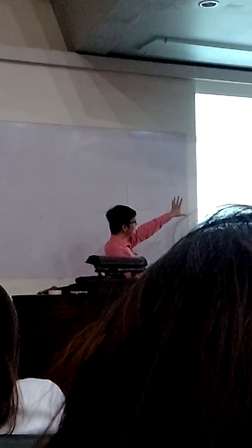So look at this. What is this? Yeah. So this is the positive. This is the positive, right? Yeah. If you remember the first picture, the figure that was presented earlier. So when we talk about axis, you just have to count the number of small squares. So lead 1, how many is it? 5, 10, 15, 16, approximately 17.